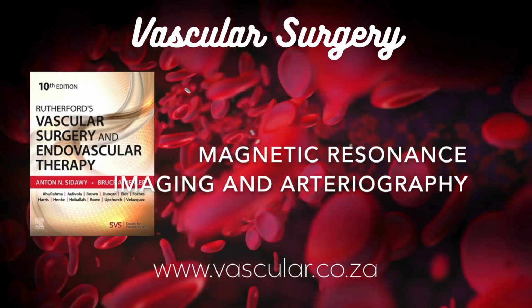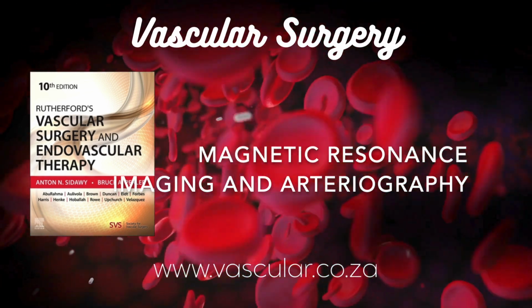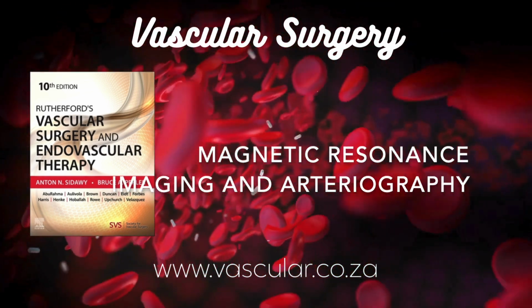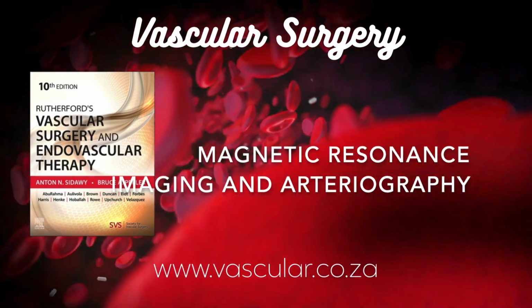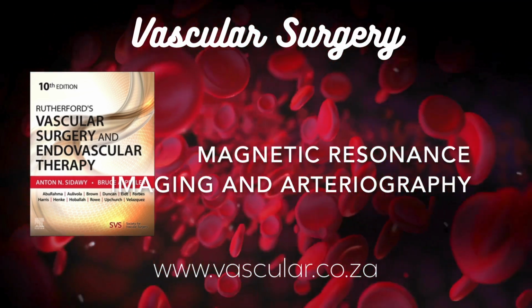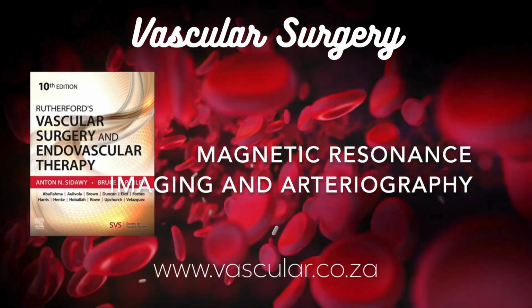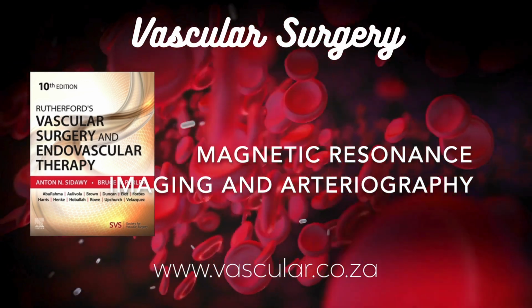Okay, crucial point. What about pacemakers and other implanted devices? Still a strict no-go for MRI. It used to be, pretty much. But things have changed quite a bit. There are now many MR conditional pacemakers and defibrillators, ICDs, specifically designed and tested to be safe under defined MRI conditions.